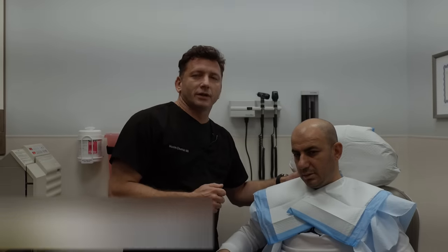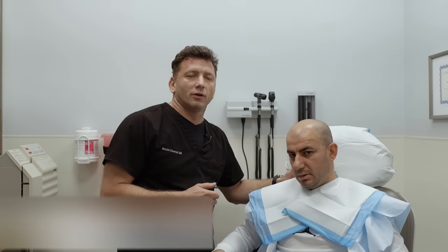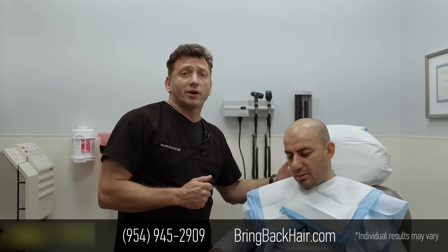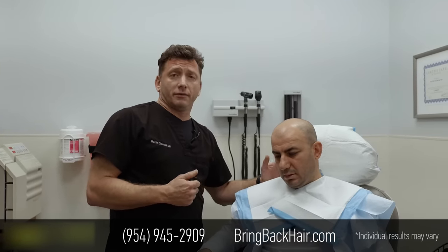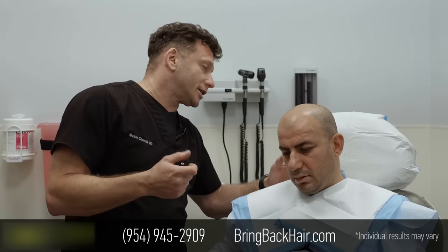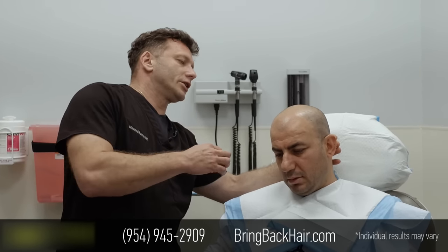Hi, I'm Dr. Max here at Max Medical Robotic Hair Transplant Clinic. We're here with Vic, who came from Chicago for a hair transplant, and we're planning to do 3,000 grafts. We have more than enough hair, and with robotic technology, we have the highest precision available on the market today for hair restoration.